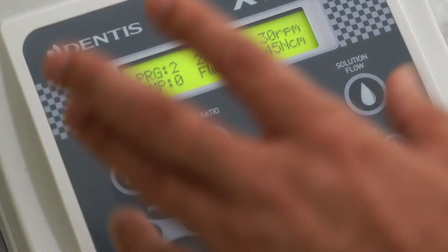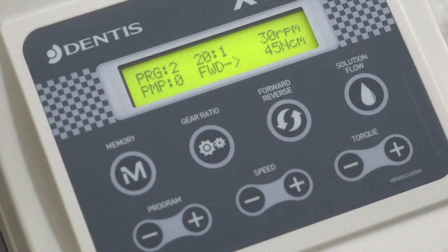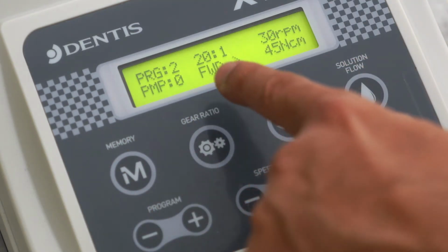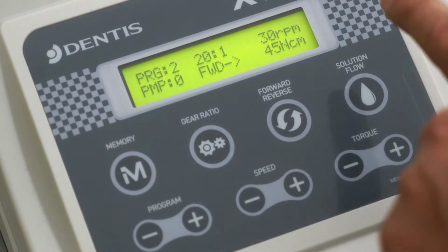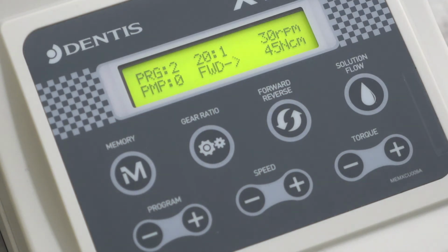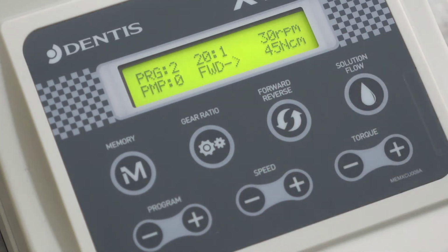We go to program 2. This is for implant placement. Pump is at 0 because there's no more water coming through. My gear ratio and my direction stay the same. But you want to make sure, this is important, that your RPM is dropped down to 30 RPM. You cannot be placing an implant at a really fast speed. And I have it set that at 45 Newton centimeters, my handpiece will stop. That is perfect torque and initial stability that you can get. It's ideal, so I have it set on that.